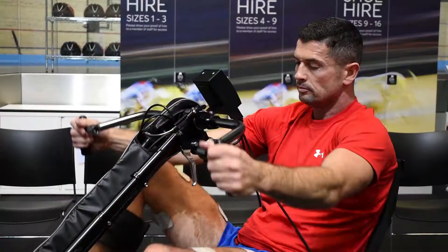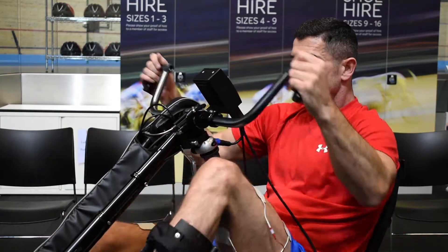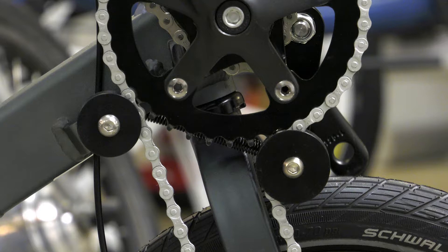Both functioning body parts and limbs with impaired function benefit from a bike ride. In only 20 minutes of cycling, each leg and each arm is stretched and bent 1000 times.